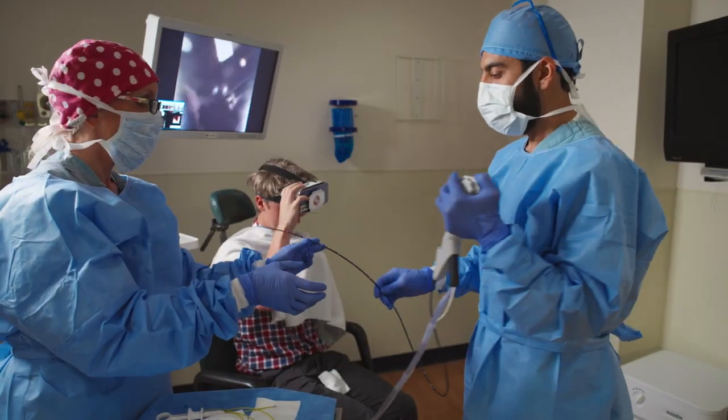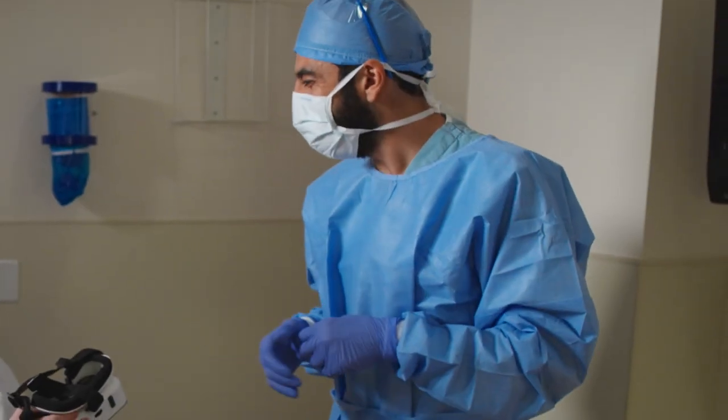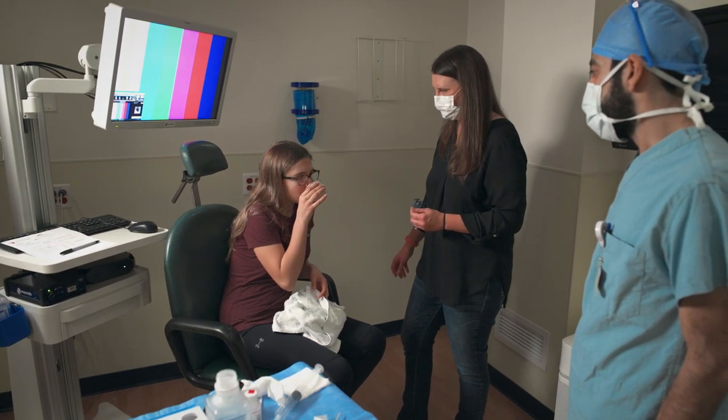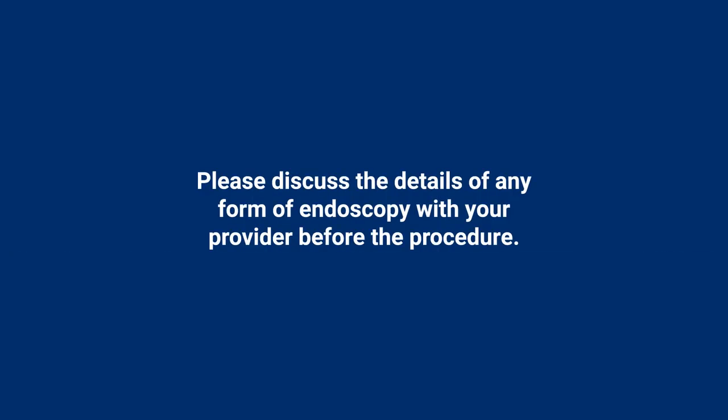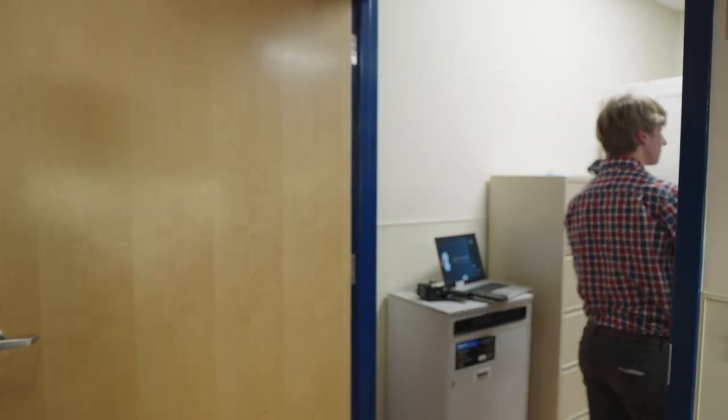The doctor will discuss what they saw and provide discharge instructions. Then you're free to go. Afterwards, you may have a bellyache, sore nose, or throat. Please discuss the details of any form of endoscopy with your provider before the procedure. After leaving the facility, you'll be able to return to your regular activities and get on with your day.